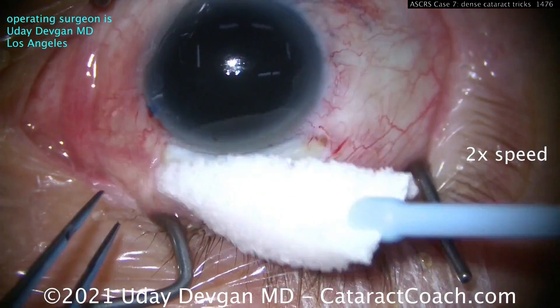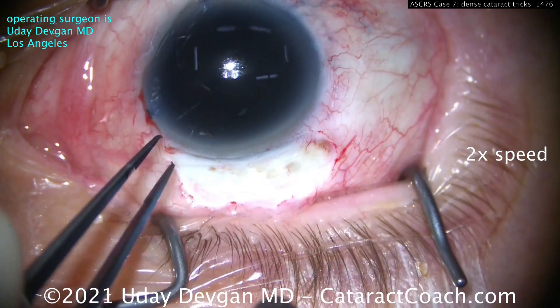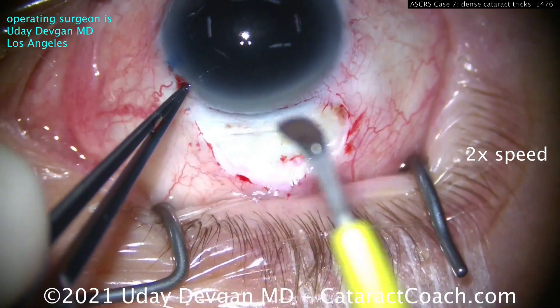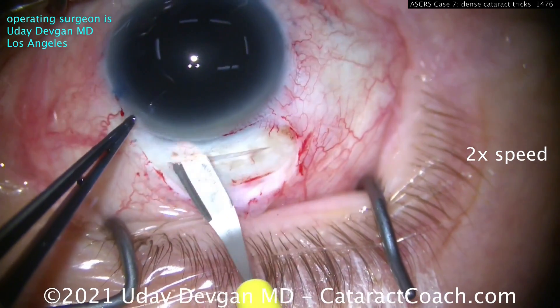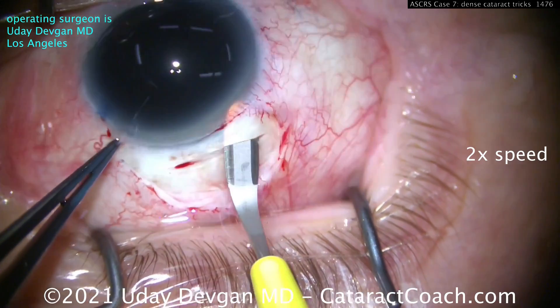Now the incision is very important. You definitely want to make an appropriate incision — it's trapezoidal in shape and about half scleral depth, going about one and a half to two millimeters behind the limbus. We'll make a half-scleral-depth groove, and then using the crescent blade we're going to create a nice tunnel — a shelved incision. Notice how the tip of that crescent is going to go about a millimeter or so into the clear cornea as well, really emphasizing that trapezoidal shape.